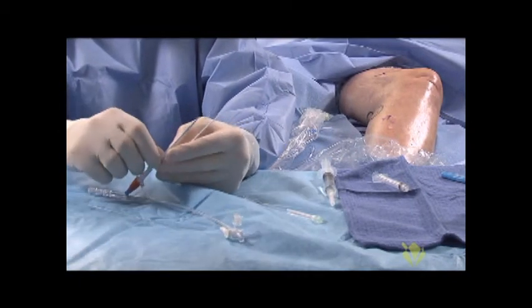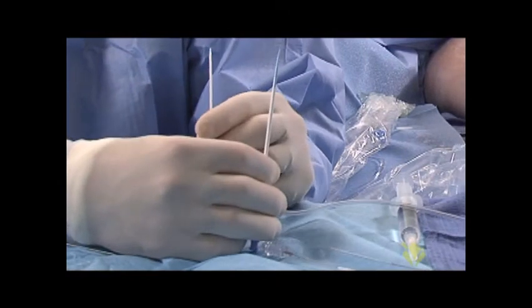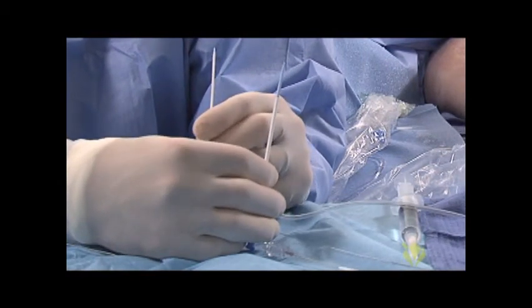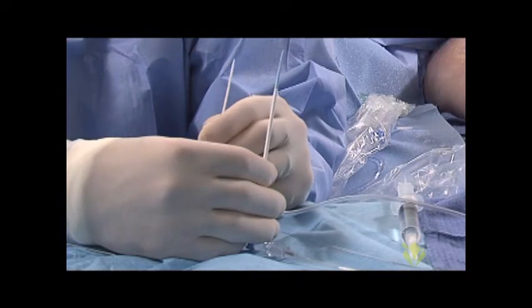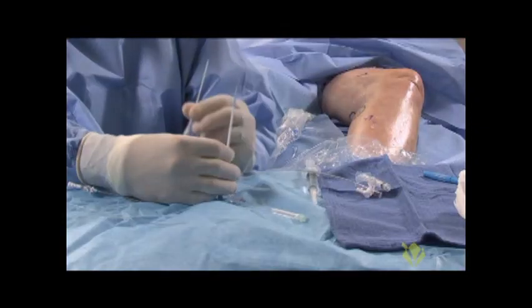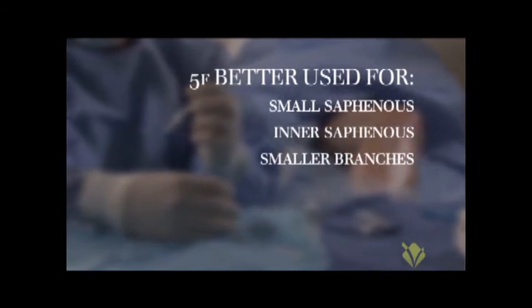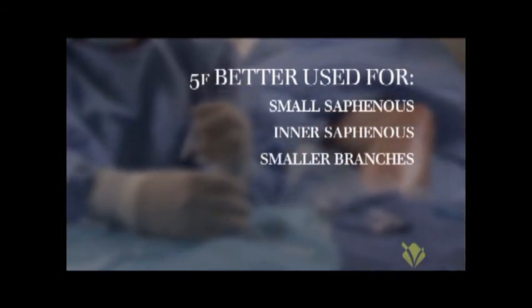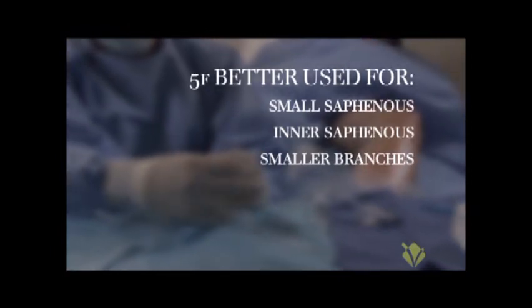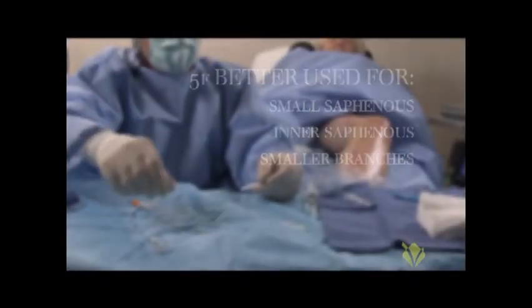If you look at the two of these in comparison, you'll see the difference in size. This is a 7 French, this is a 5 French. It doesn't seem like much, but for smaller veins — Giacomini or inner saphenous, the small saphenous, smaller branches — this is obviously much easier to get into a two to three millimeter vessel than the 7 French catheter. So there's your difference between the two types of introducers that we use.